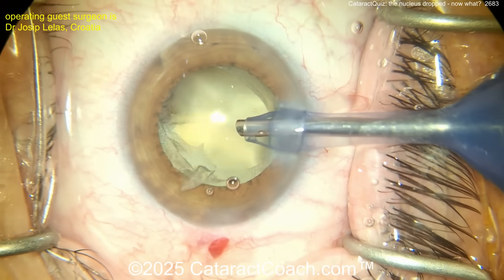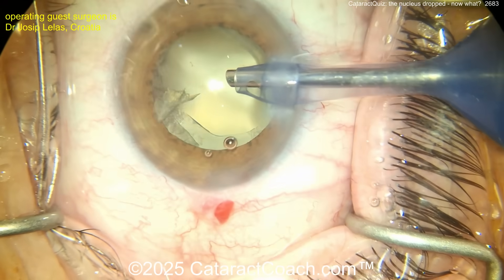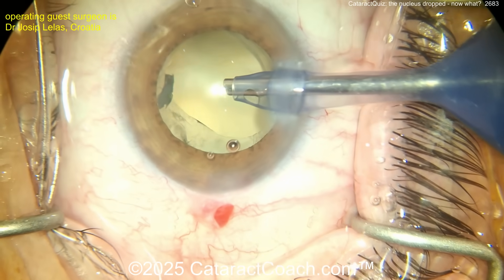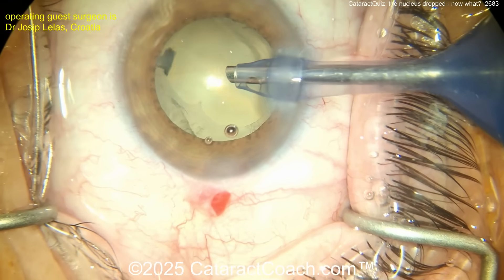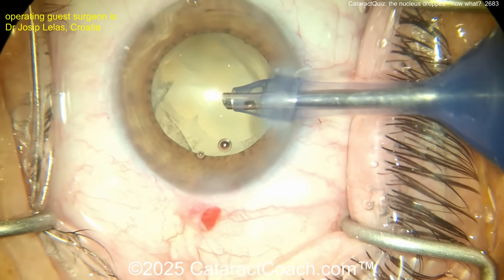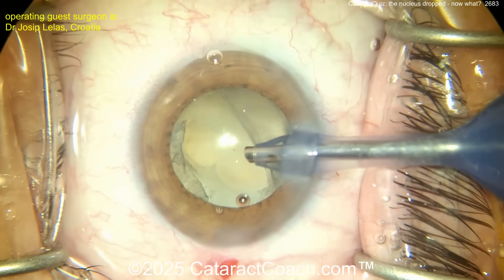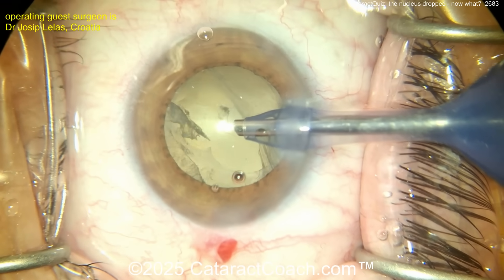What's the answer here? Stabilize things. Why did it rip? It looks like maybe it was that area where the rhexis ran out and kind of zipped to the posterior capsule — maybe that's it. Not 100% sure, but this is the point of disbelief: oh my gosh, I can't believe this happened. You need to call for some more viscoelastic — inject through the paracentesis to get the anterior chamber deepened up.